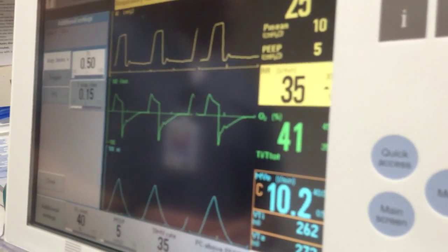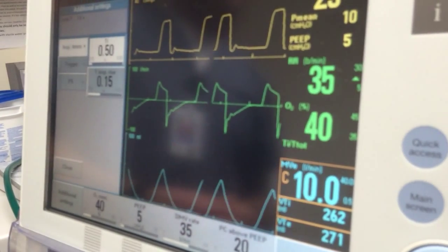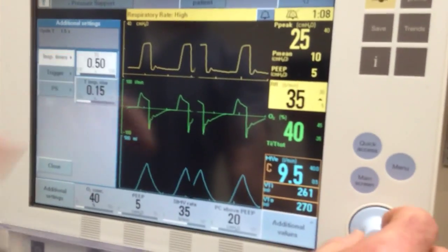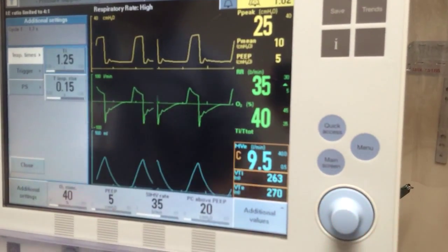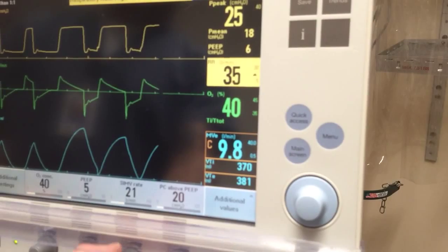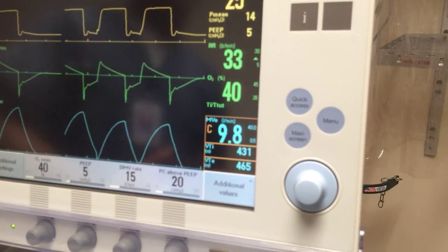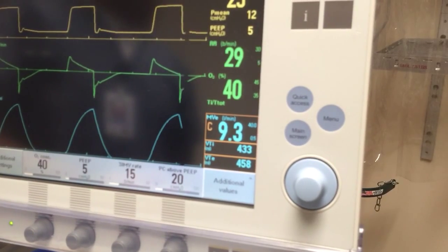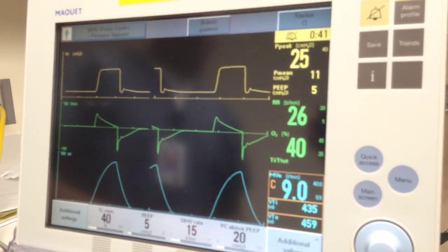And your rate is so high because you're trying to ventilate just the upper part of the lobe, or the most compliant part of the lobe. So it's usually, clinically I found, better to first start with the 0 flow, minimally, if you're first initiating a vent, and then move my rate down to allow them to exhale with that I time, and evaluate your end tidal and your blood gas to see if that's not going to work for you. But 9 times out of 10, it typically is a better way to ventilate than to just shorten your I time so that you can exhale all the way because of the rate that's set.